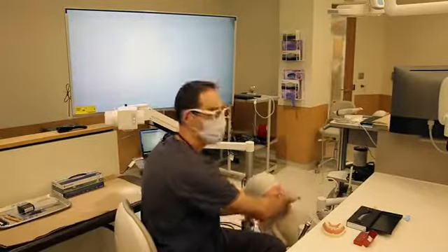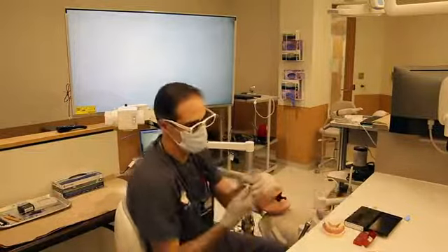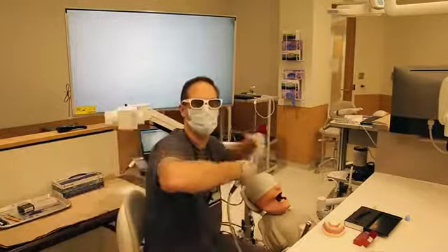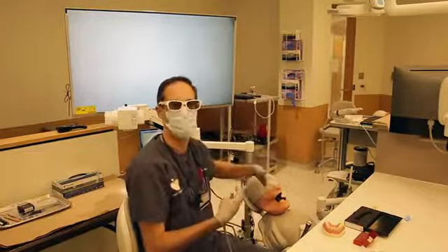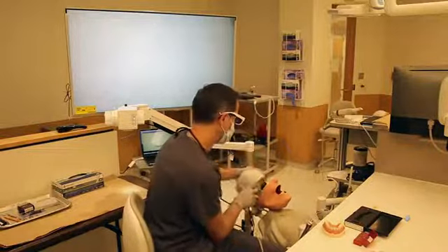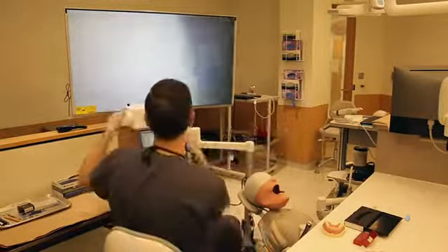So many times if I want to show a student exactly what I want them to do in the preparation and where I would like them to make an improvement, again, in the past, I would have to do work while a student is crowding over my shoulder, or maybe 2 or 3 of them are looking over my shoulder to see exactly how I'm approaching this restoration or preparation. With this technology now, I can broadcast this whether it's to one student or a group of students that are here, or live over a Zoom.